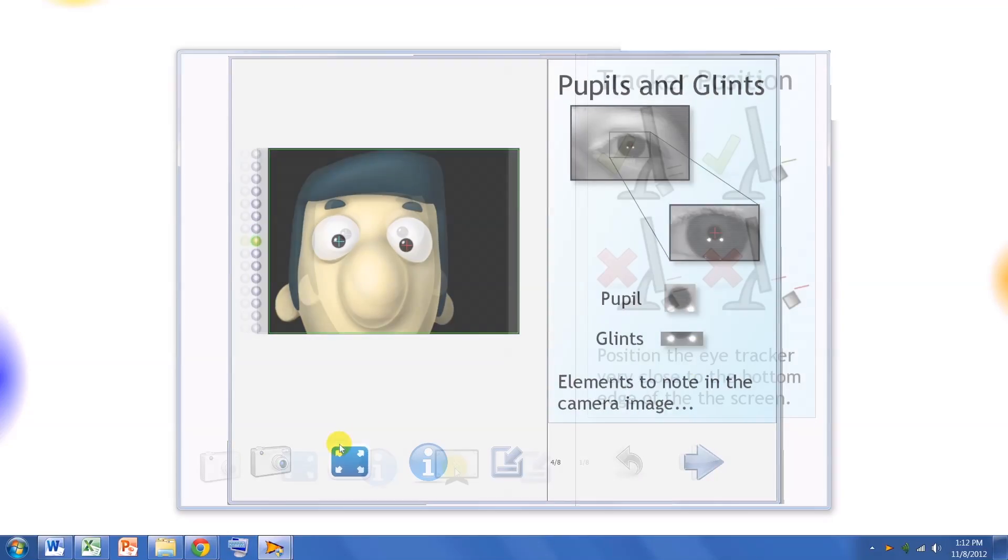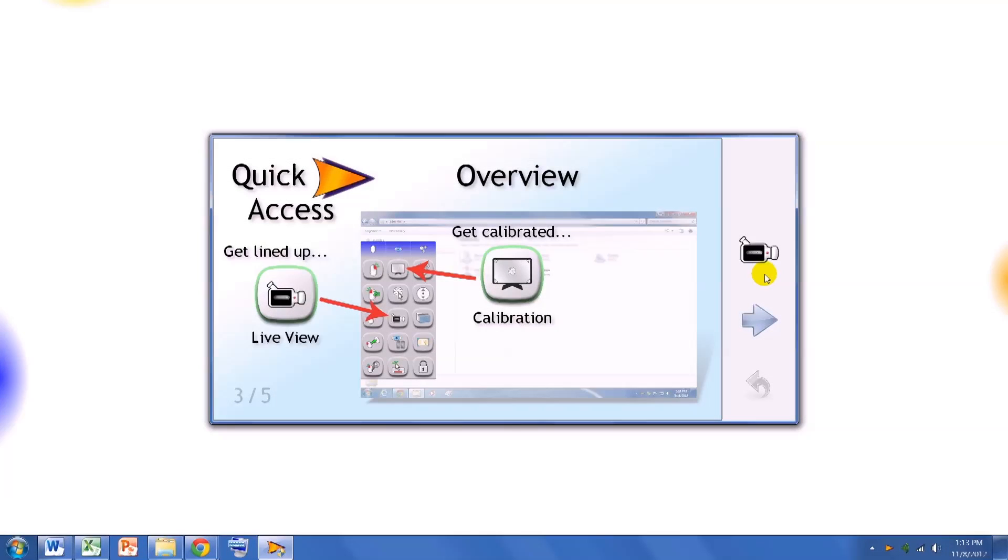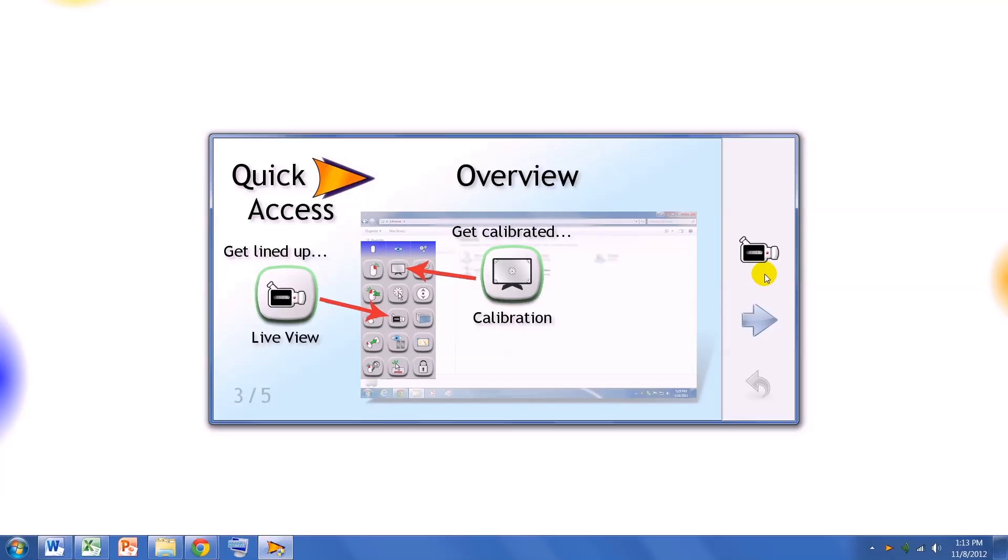Now let's move on to our new animated calibration, designed to make it easier for individuals of all ages to calibrate. By default, it is a 16-point calibration, which provides the highest level of accuracy. A quick 5 or 9-point calibration is also available. Simply look at the point as it moves around the screen. It is that easy. The new calibration is designed to maintain calibration, meaning there is no need to have to recalibrate.